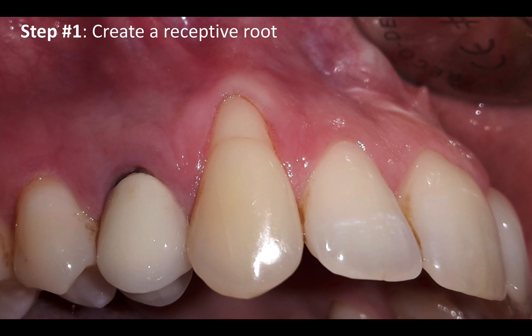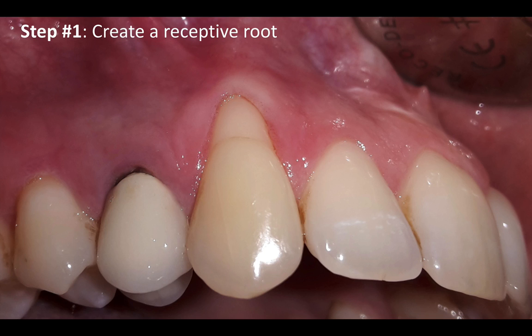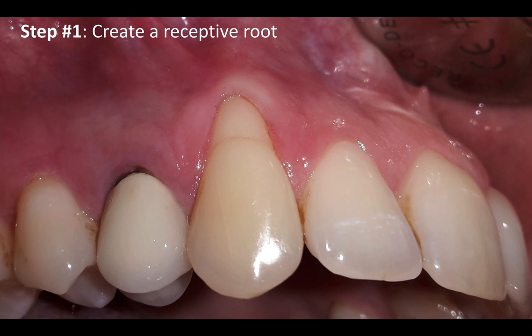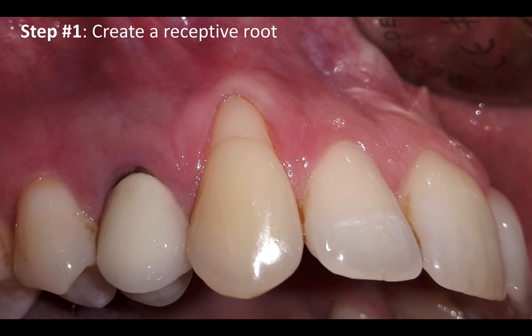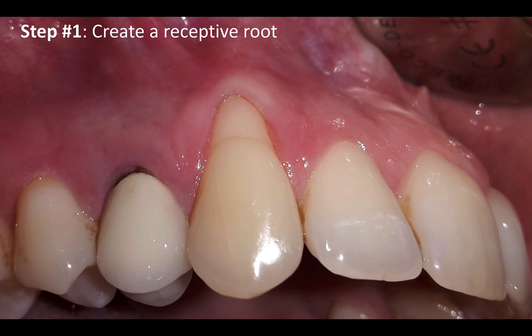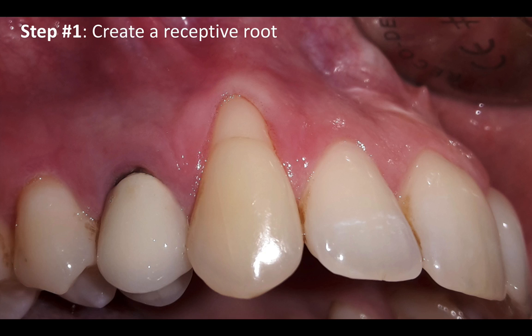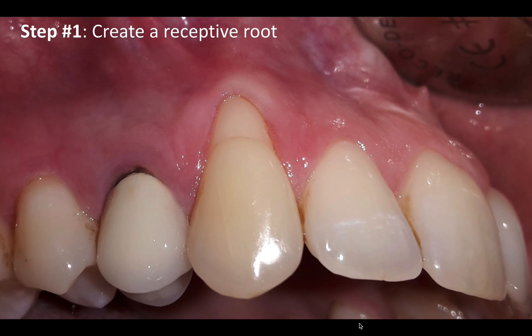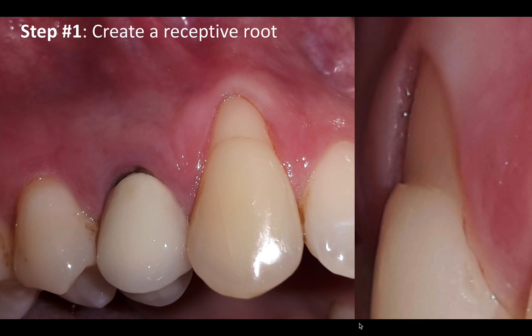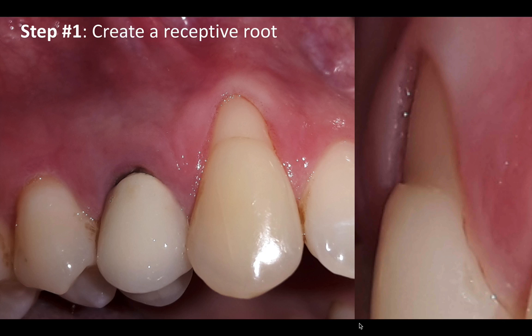The first step for any grafting procedure is to make sure that the root you're grafting is receptive — meaning there's no restoration, no contamination, calculus, or caries — so the new tissue can adapt to the receding root and also attach to it through a long junctional epithelium. So if you see a restoration, it's important to remove it and make sure that the root is relatively flat. If it's not part of the procedure, it's root flattening.